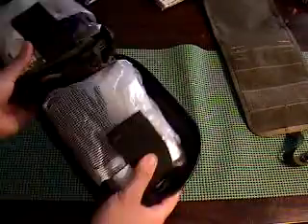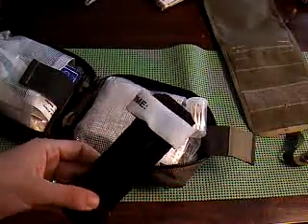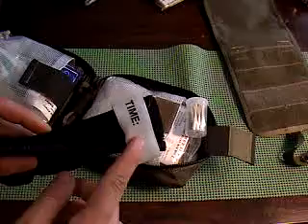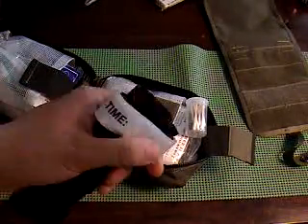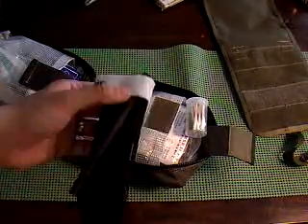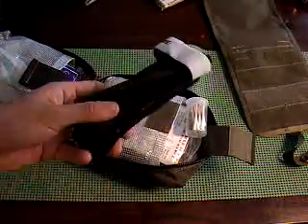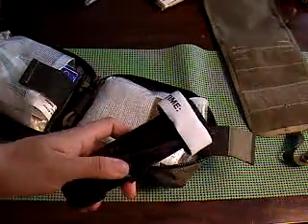Moving on to the other side, I've got a tourniquet — this is a CAT tourniquet, one of the newer ones. The older ones have black velcro, but this new one has white so you can mark the time you apply the tourniquet. If you use a different tourniquet without that, you always want to mark what time you applied it — the best way is on the forehead with a Sharpie, or you can mark it with blood. I plan on putting a Sharpie in here.